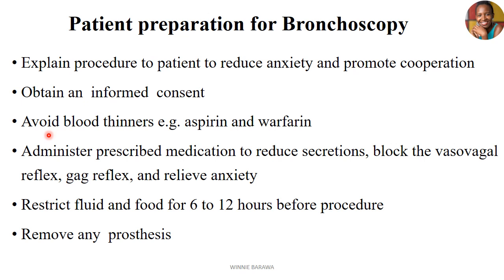Then, because it's a procedure that requires us to go in with a bronchoscope that you can see has clippers, has brushes, sometimes you may need to use a needle if you need to do needle aspirations, and so you need to avoid blood thinners for the patient. For instance, before a bronchoscopy, a client should not take aspirin or warfarin, as these are known as blood thinners, that is, they can worsen bleeding in case it happens during the procedure.